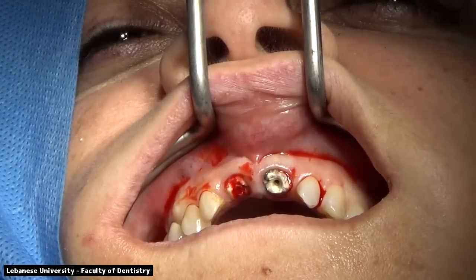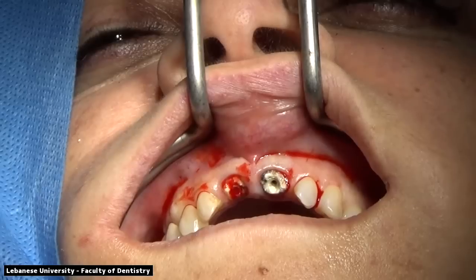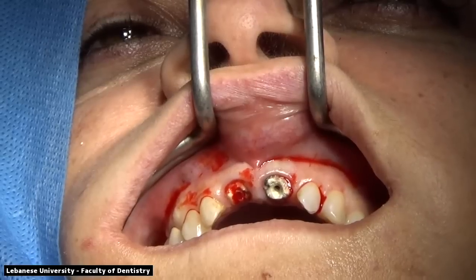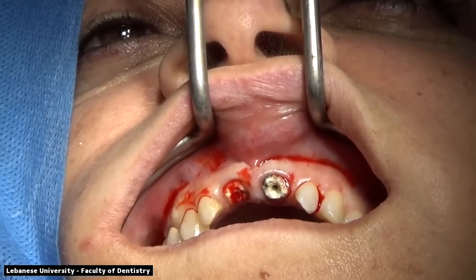Usually with endodontically treated teeth, it will be harder to extract those remaining roots as the teeth become very fragile, and so we have to be very careful during extraction, using periotomes and using minor techniques to make the extraction as atraumatic as possible.